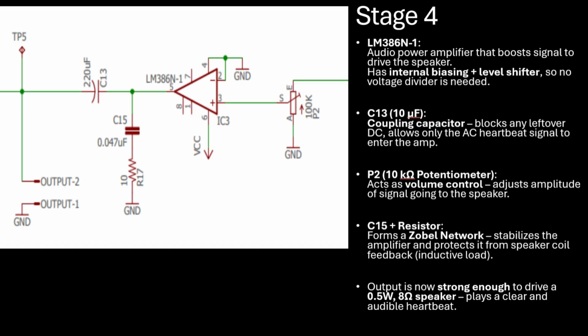The input signal is AC coupled into the LM386 through C13, which blocks any remaining DC offset and lets only the AC signal, the heartbeat, pass through. The gain of the LM386 can be set externally. In our case, we use a potentiometer P2 as a volume control. This allows users to adjust how loud the heartbeat sounds from the speaker.